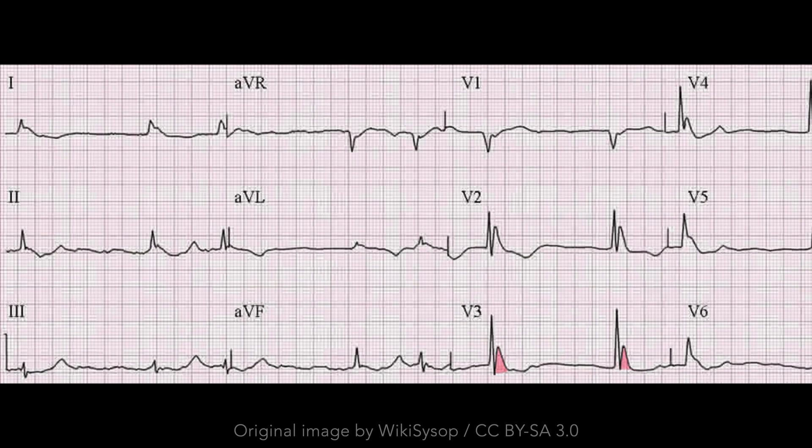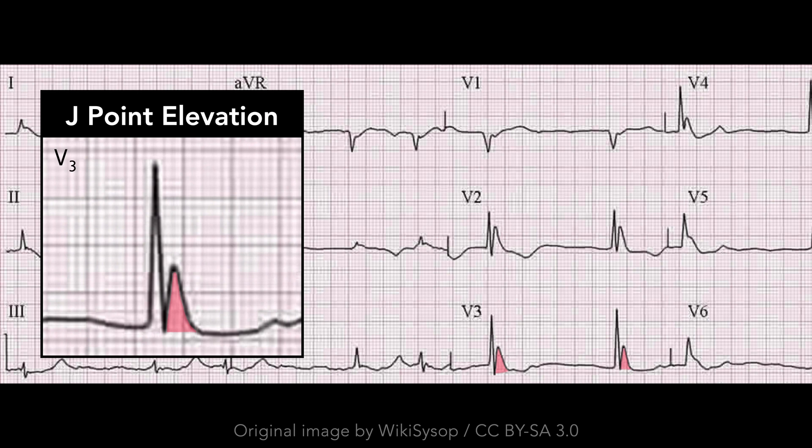With hypothermia, a classic electrocardiographic finding is J-point elevation, also known as the Osborne J-wave. Note the prominent convex deflection at the junction of the QRS complex and the ST segment. It is most clearly evident in the precordial leads and typically negative in leads AVR and V1. The amplitude of the J-wave roughly correlates with the severity of hypothermia.